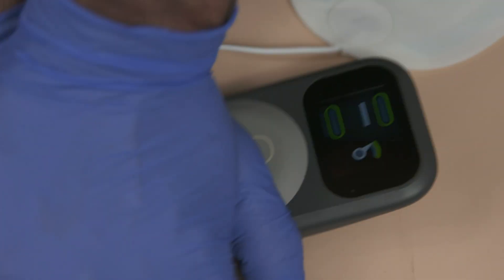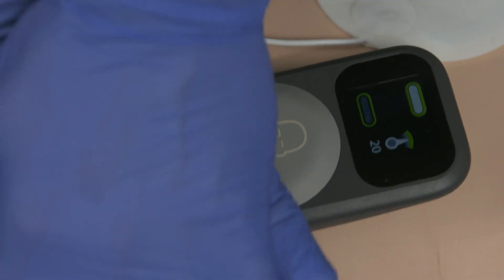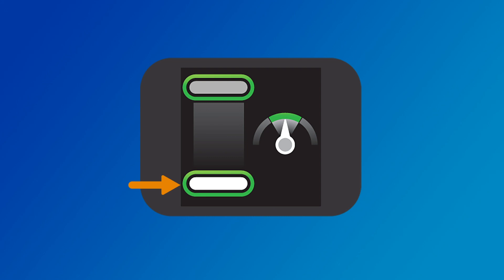The CPR meter provides feedback about compression depth and if you are completely releasing pressure after compression. It also provides feedback about compression rate. When the correct compression depth is achieved, the bottom target lights up. When the pressure is completely released, the top target lights up. If your compression fails to meet the target depth, the compression depth target zone does not light up. If four consecutive compressions fail to meet the depth target, a yellow arrow appears on the display pointing to the depth target zone.